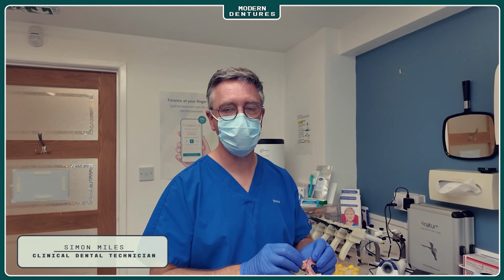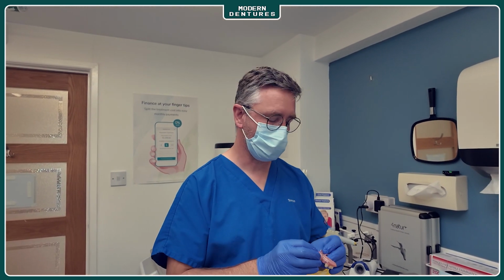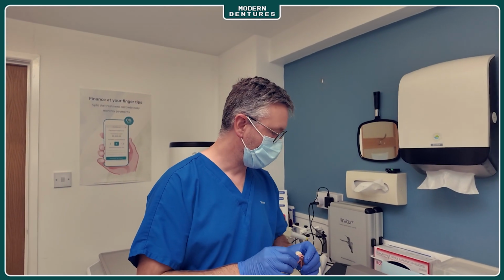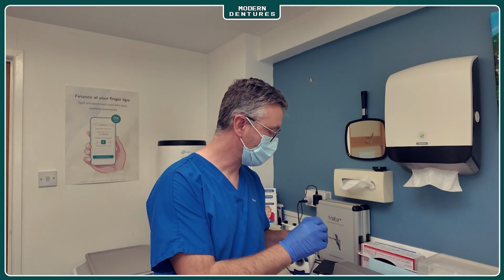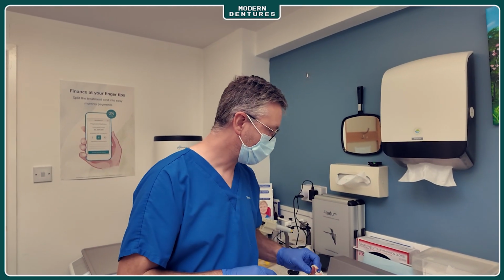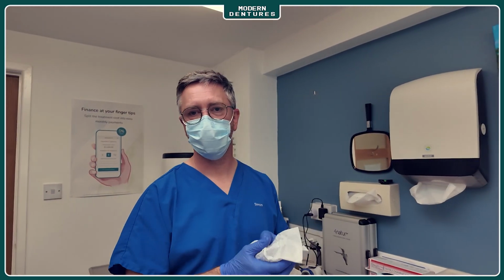Shape wise, this is one that we made a little while ago, so we should still have the shape for this on the system, and we're matching with these. They look like an A2, but I'll get the nurse just to check the shade on those. These are also Enigma teeth, Enigma Life, so we'll make sure that we use Enigma Life teeth on the lower ones as well, so they match in perfectly.